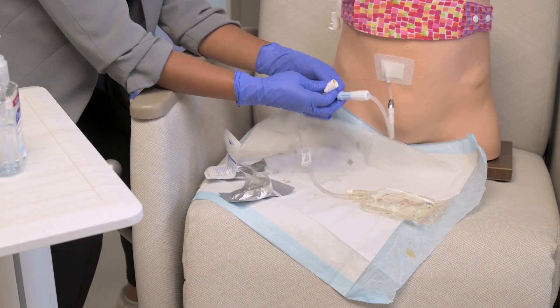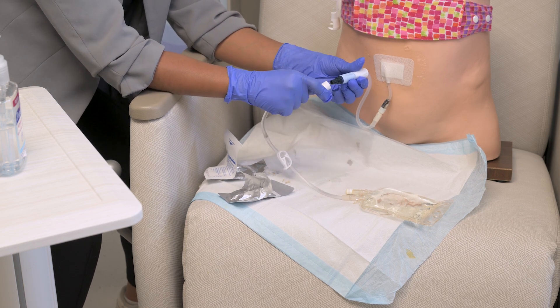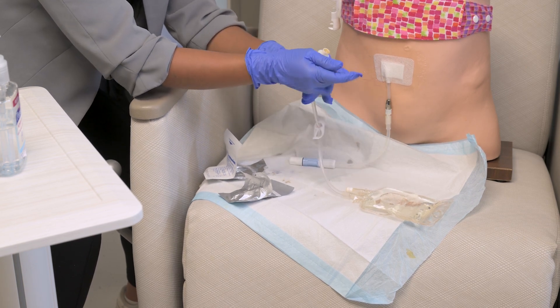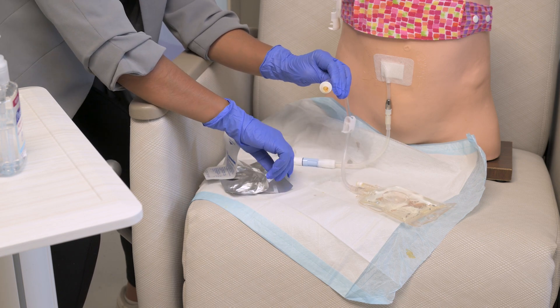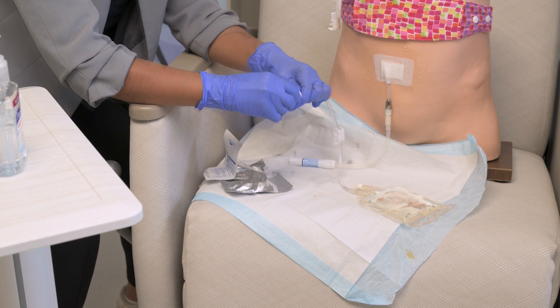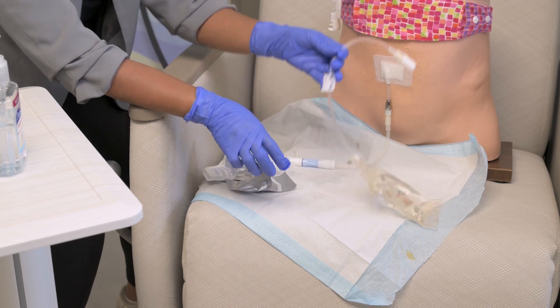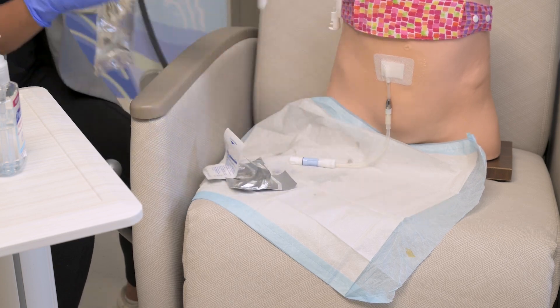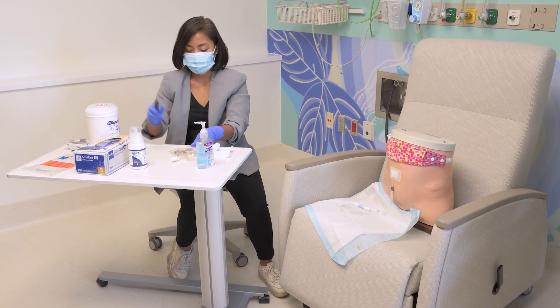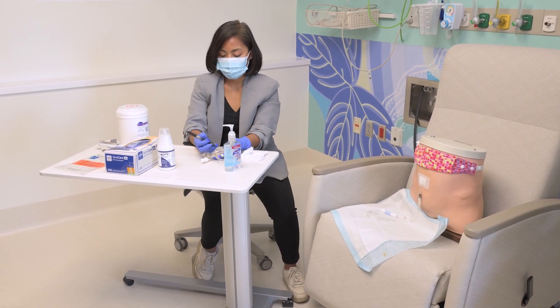Disconnect the effluent bag. Place the new mini-cap on the end of the transfer set and put a new mini-cap on the effluent bag. Write your child's name on the label on the effluent bag and take it to the designated lab.